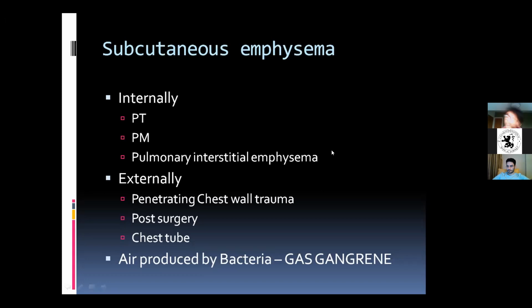Okay, so we'll, yeah, okay, fine. We don't need a break then. So we'll just go over to cardiac pathologies, the cardiac silhouette, as well as the mediastinum.